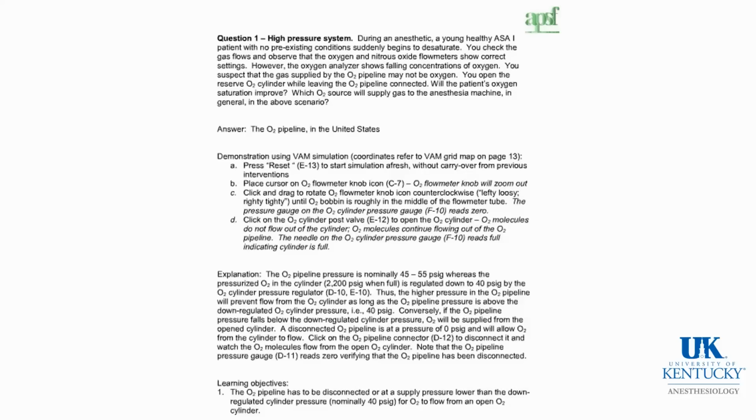I believe the same question is answered here, except that it raises the question of whether the gas supplied by the oxygen pipeline may not be oxygen. So if the primary source is the pipeline, and you feel that the pipeline may be contaminated or not oxygen, what you must do is disconnect the oxygen pipeline from the anesthesia machine, and that is outlined in this learning objective at the bottom of the slide.